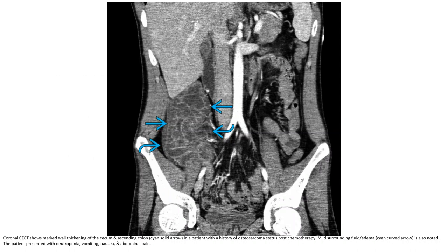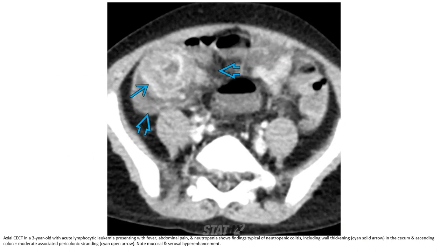Contrast-enhanced CT in a three-year-old with acute lymphocytic leukemia presenting with fever, abdominal pain, and neutropenia, showing findings typical of neutropenic colitis including wall thickening in the cecum and ascending colon, plus moderate associated pericolonic stranding.